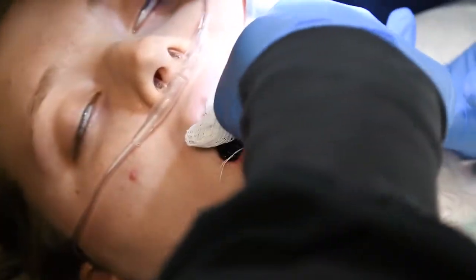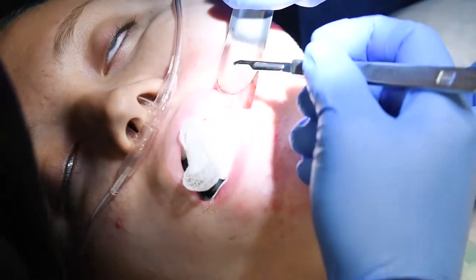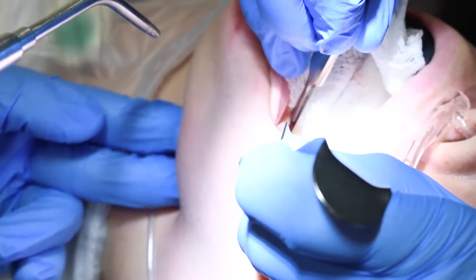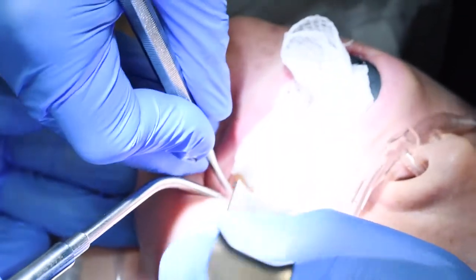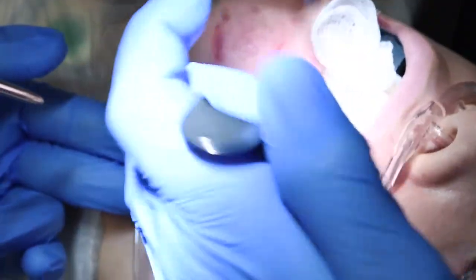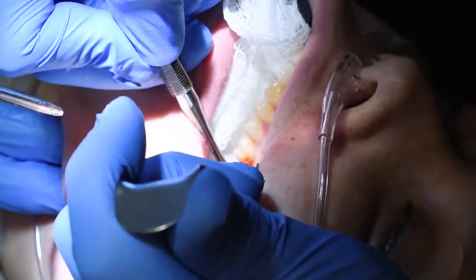These teeth are what we call impacted, so I need to make an incision to get access. We're going to make the top incision and the lower incision at the same time. Then I move the gum tissue out of the way — it's called raising a full thickness flap so that we can see the surgical site below where the wisdom tooth is.